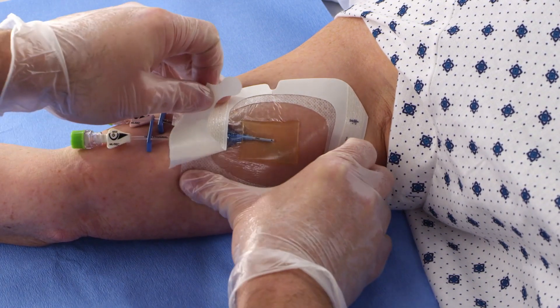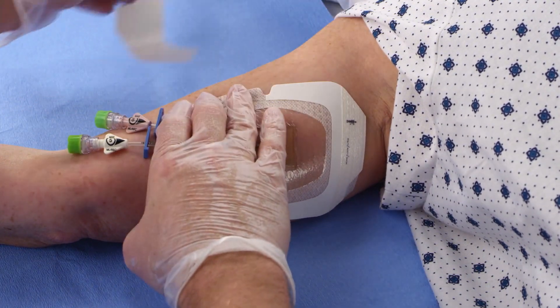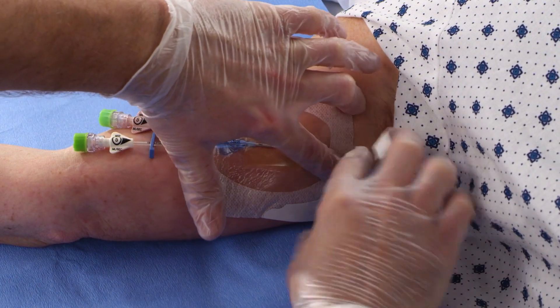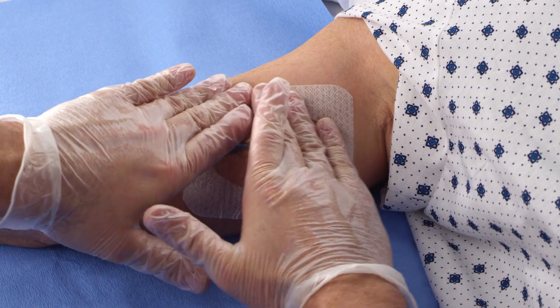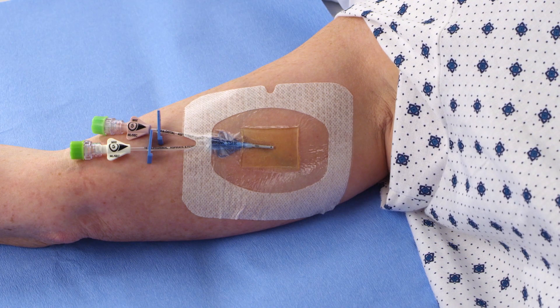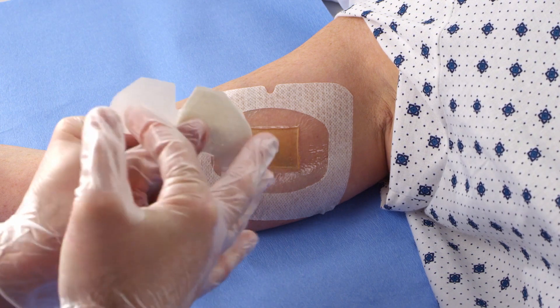Apply firm pressure to the entire dressing before and during removal of the paper frame in order to enhance adhesion. Slowly remove the paper frame while continuing to smooth down the outer edges of the transparent adhesive dressing. Smooth the Tegaderm CHG dressing from the center toward the edges using firm but gentle pressure. The adhesive is pressure sensitive, so pressing into the contours of the site will greatly enhance adhesion.